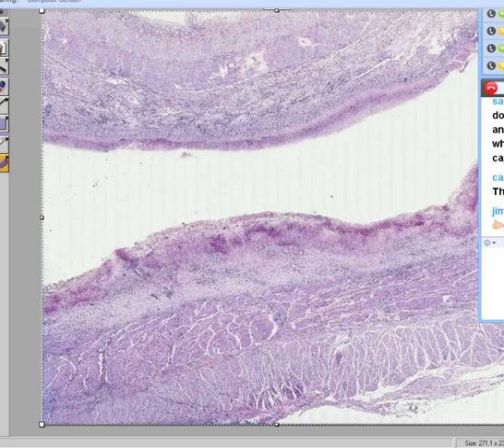So you can see the muscle layers pretty good. You can see the serosa pretty good. You could see the submucosa pretty good. But the mucosa looks all fuzzy and purple and like it's not even there. Correct? Can everybody see the slide?